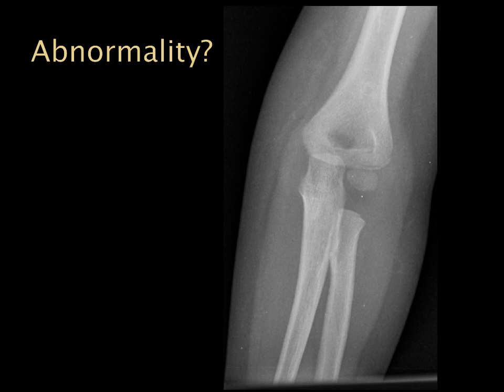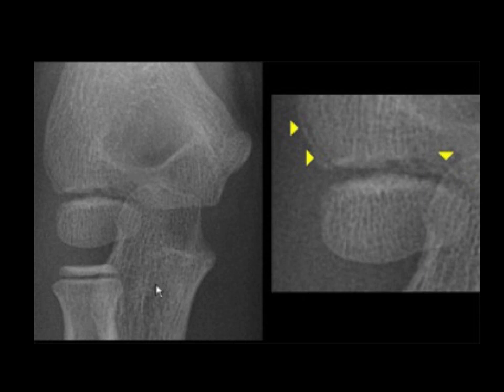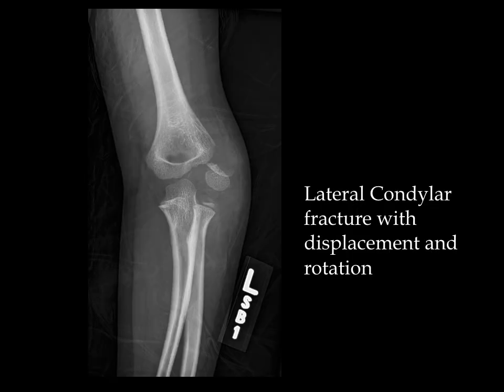The abnormality on this x-ray — which may be a little subtle — is a lateral condylar fracture. Here are zoomed-up views of another lateral condylar fracture. In a more extreme version, we actually get displacement of the condyle itself as well as rotation.